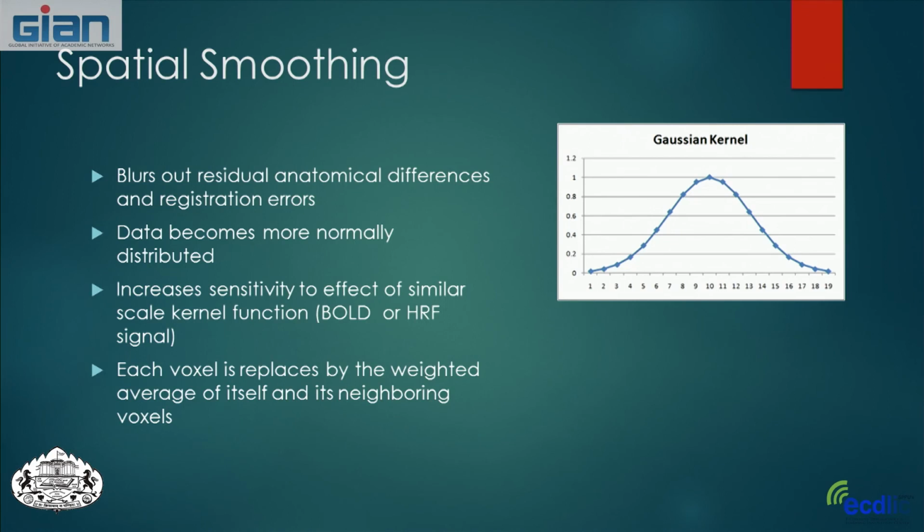So the alternatives in both cases aren't that great. And of course, if you're going to do each person's brain like that separately, it takes a lot of time to do. The last thing that's typically done in our processing of our brain is called spatial smoothing.